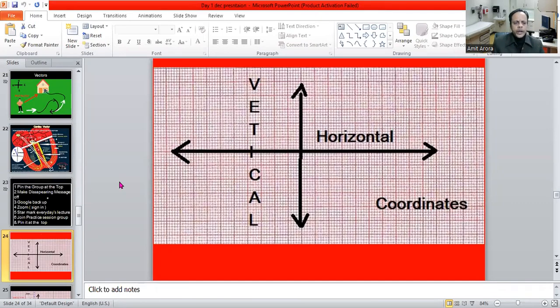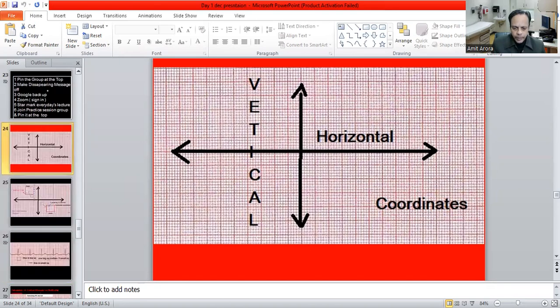In the horizontal coordinate, we are going to calculate the intervals like the PR interval, QT interval, and heart rate. This is the unit of time, in seconds or milliseconds. So in the horizontal section we will measure the interval or time. Let me show you how with one more slide. We'll come back to that also.